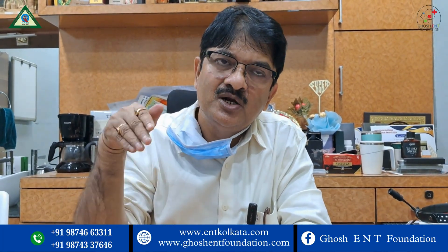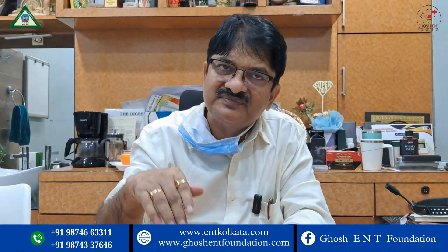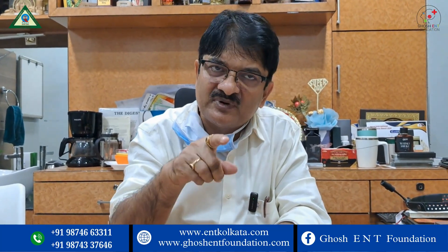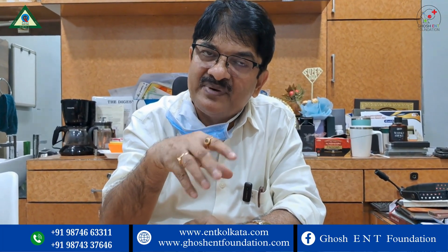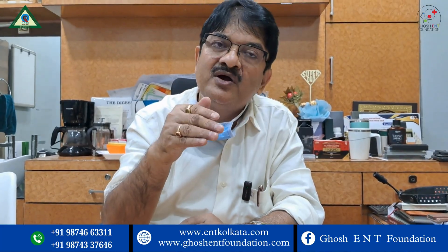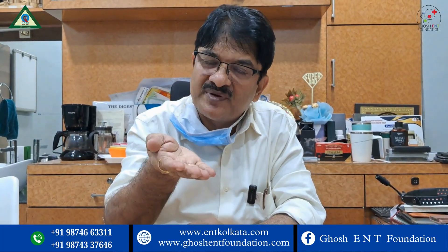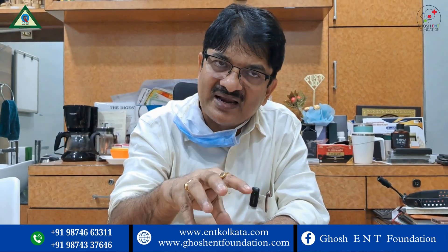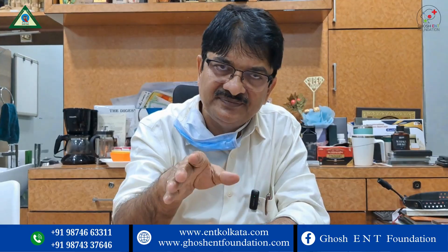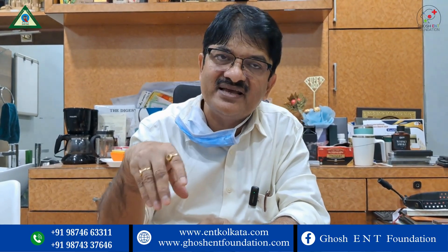If you consider the turbinate, the anterior two-thirds and posterior one-third: the posterior one-third sometimes has a polypoidal appearance, and with allergic reaction there will be hypertrophy again. To address this, I will debulk the posterior portion totally with micro debriders, while the anterior part uses a mucosal-preserving technique.